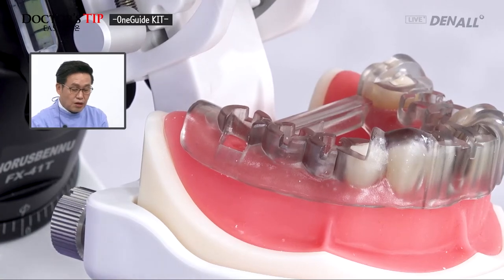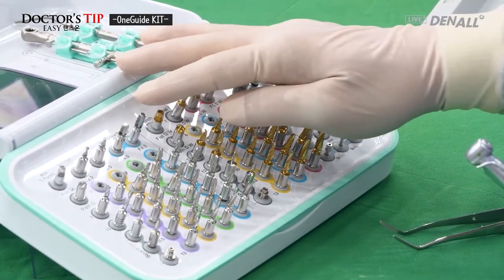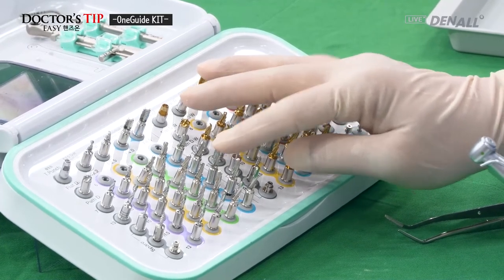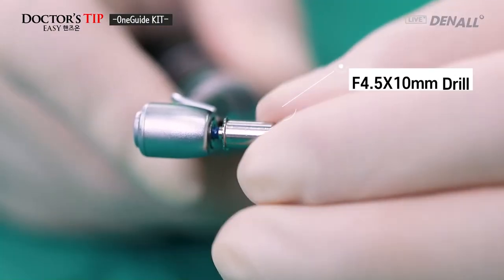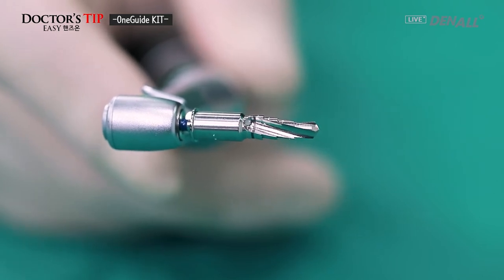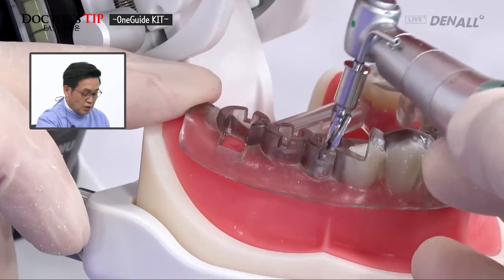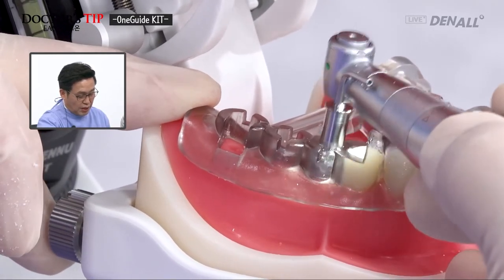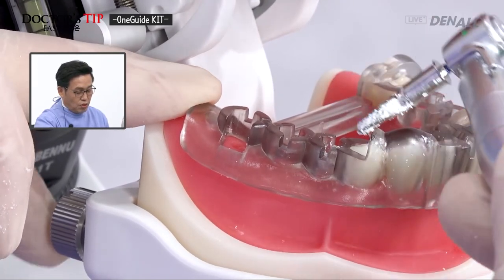3.5 millimeter drilling is now done for 45. 4.5 by 10 millimeter is going to be placed. The 4.5 by 10 millimeter final drilling is going to be done. After you place the drill, choose the drill. The 3.5 drilling is done, and in that area, as shown, the 4.5 by 10 millimeter drill is going to be used full length. To minimize heat generation, you're going to do an up and down motion.